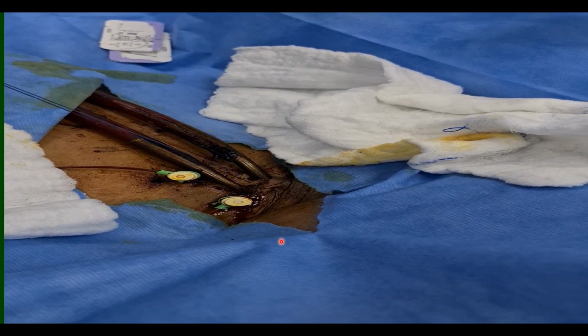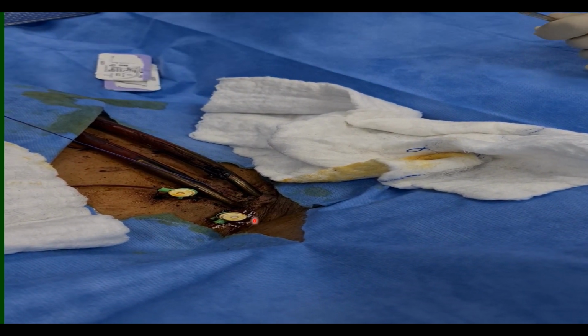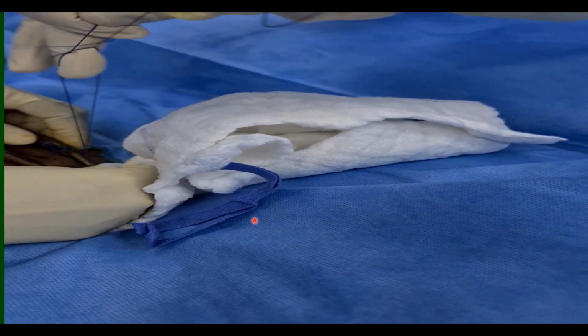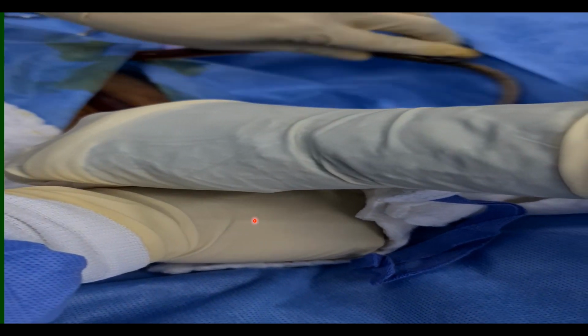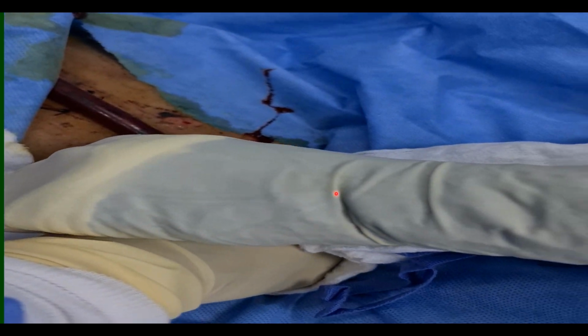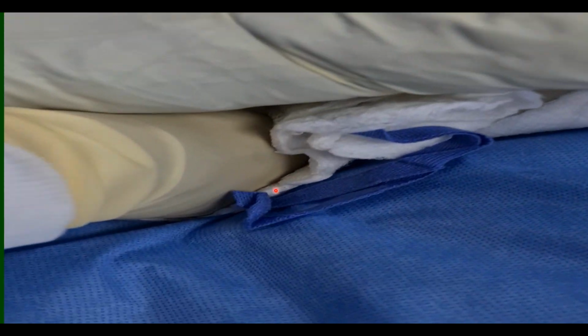Now they tie the suture together and make it tight. This is one side, and that is the other side. They make ties with them. One of the operators ties it carefully, taking multiple ties to be sure that the opening of the vein is strictly tight, and the other one takes out the cannula. Now it's out, and they allow some blood to come out during this procedure.